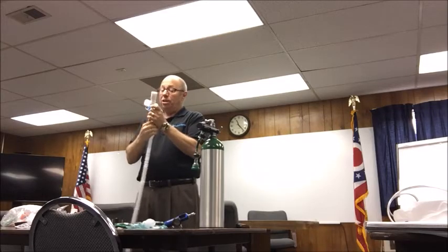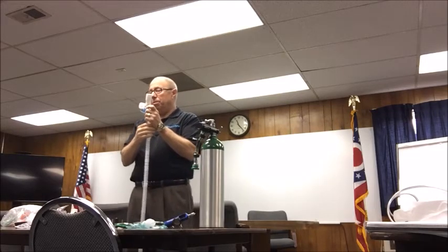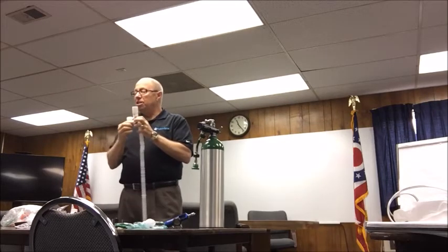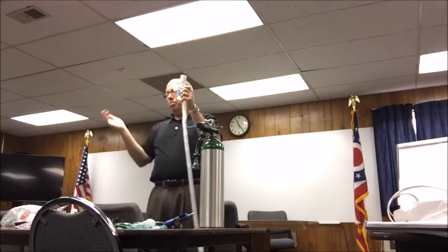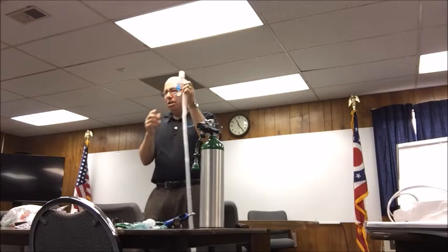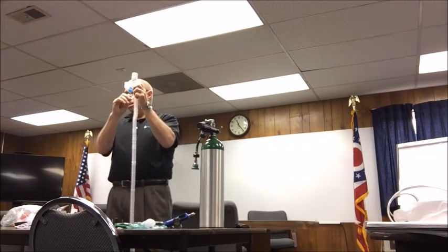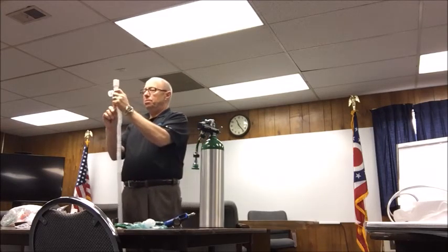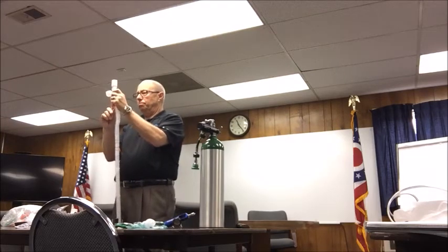We actually had it built the next day on our 3D printer, plastic printer. Our T2 is different than any one out. Well, there's one other out there, but this has a check valve in it. This is still a closed system. This is nothing more than a dust cover. So when I insert the canister, the check valve goes up, it goes down.